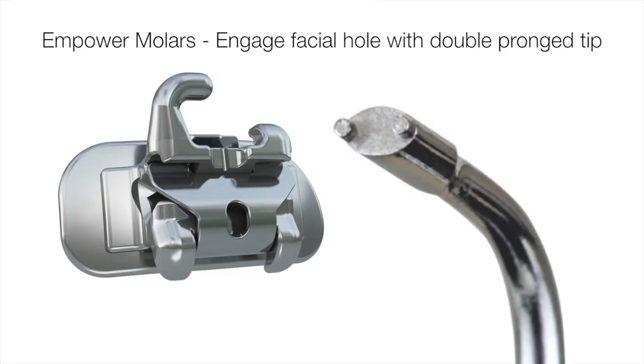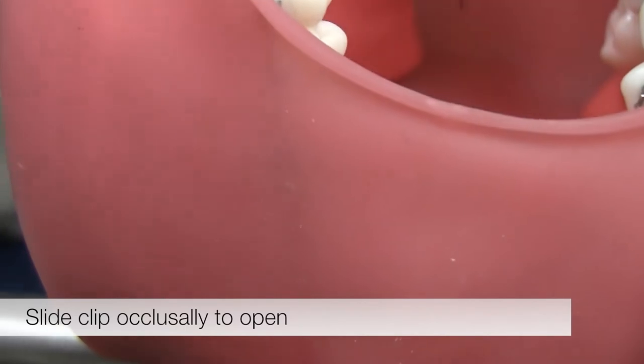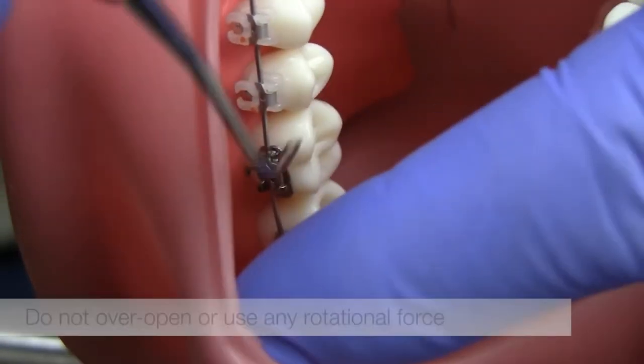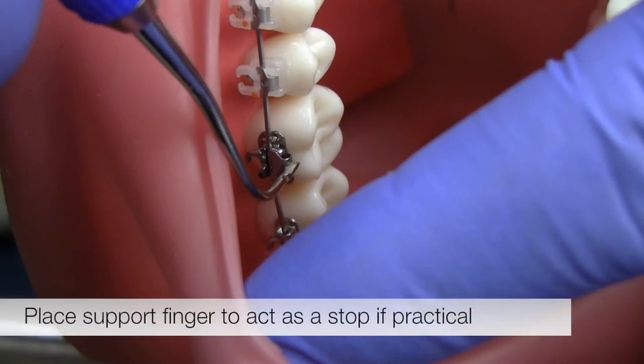Empower molars should be opened using the double-pronged tip of the instrument to engage the facial hole. Insert one prong of the instrument into the facial hole and slide the clip occlusally to open. Don't over-open or use any rotational force as this could distort the clip. If practical, place a support finger to act as a stop to limit the clip's opening.